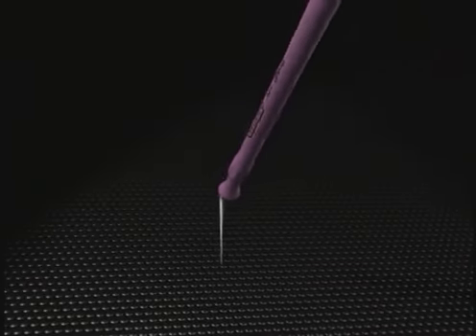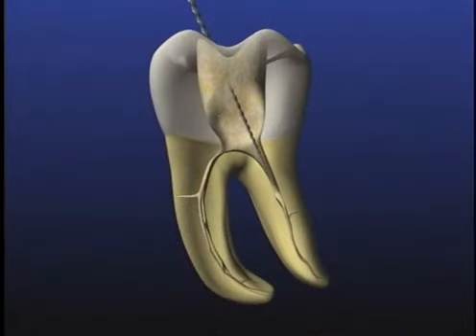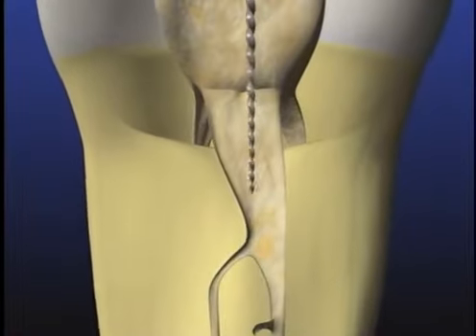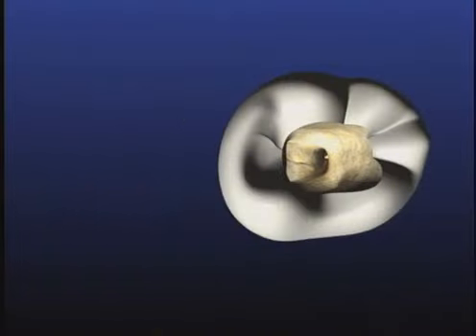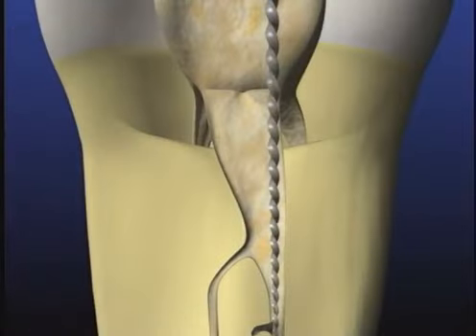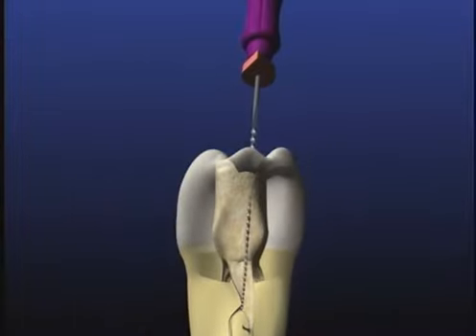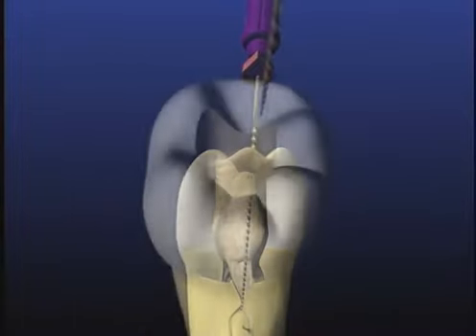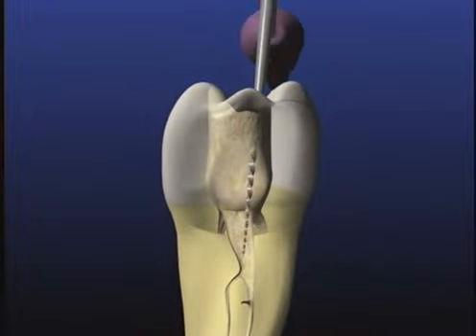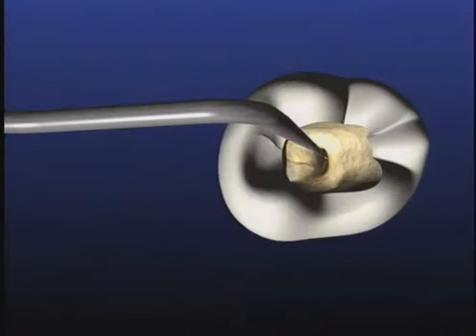Here's why I like the micro opener in the difficult to find canal case. Broad roots oftentimes hold more than one system. Oftentimes the division is far below the level of the orifice. Typically, handles and fingers that engage those handles block and limit vision, and even when you can begin to get into the canal, oftentimes the instrument collapses as it is too thin in its taper. A micro opener has an offset handle and can be pre-curved, and because of their double and triple tapers, they afford the rigidity one needs to begin to move into these canals.